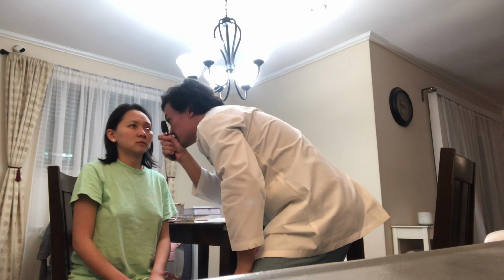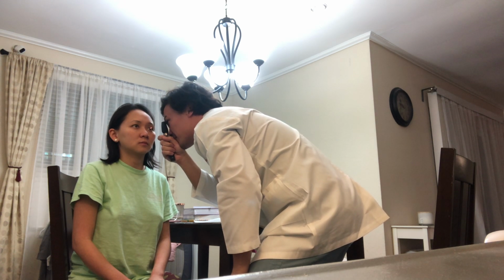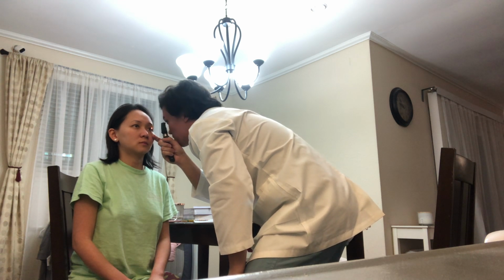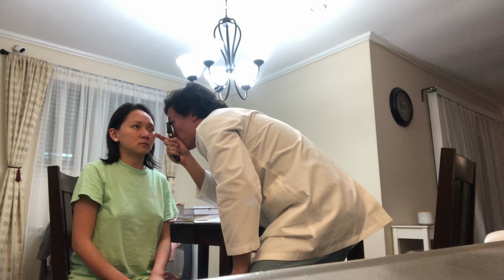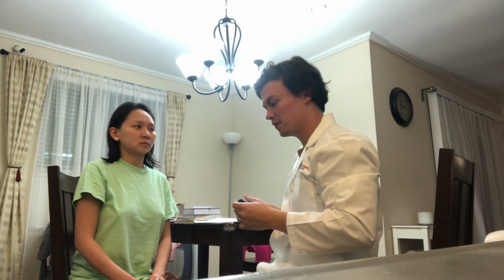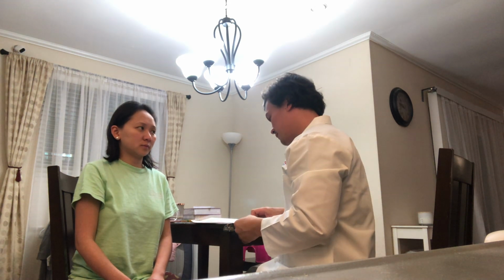The ophthalmoscopic exam is where you use the ophthalmoscope. You check for the red reflex by asking the patient to look straight, and then you check for the magnification. From the red reflex, you check for the inner side of the eye. And then you check for the optic disc, fovea, and then the macula. And you will do the same thing in your other eye.